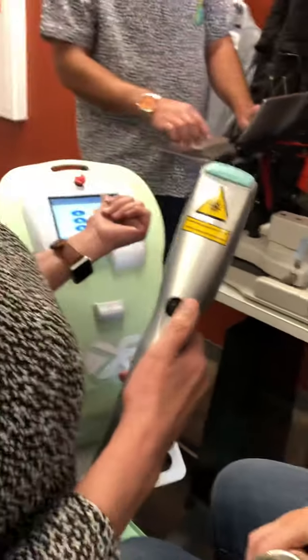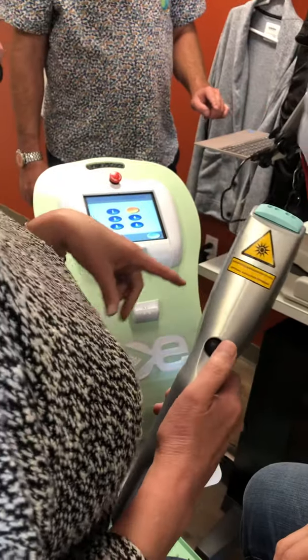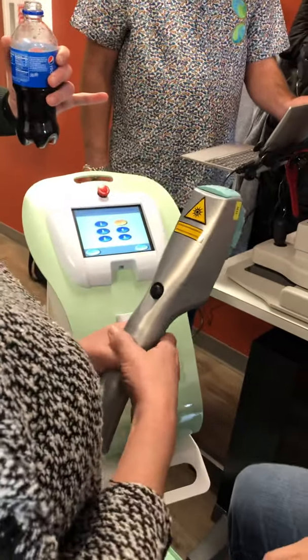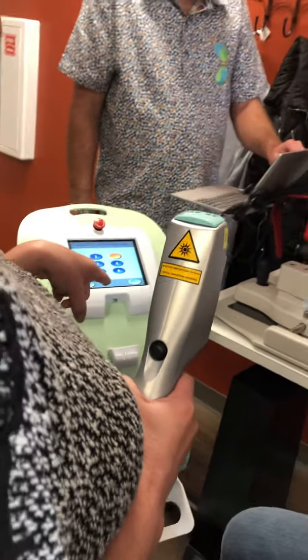And the instrument says she's a 2. Okay? So you can do it without doing that? No. What this did is this gave me her skin type. Ah, okay. So if I did her dry eye, she might be a 3. The first one was her dry eye. So the higher the number, the darker. The first one is a prediction of how much degradation there is in the meibomian glands. The second one is what is the skin type.